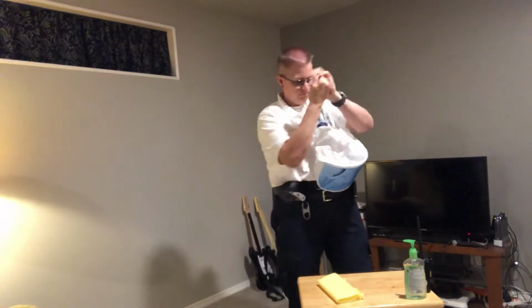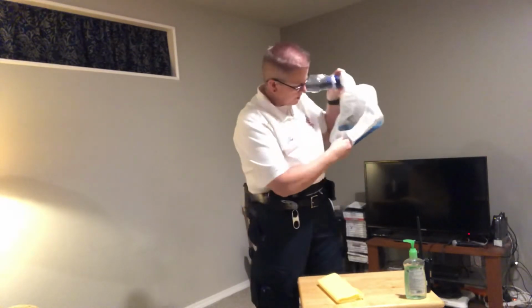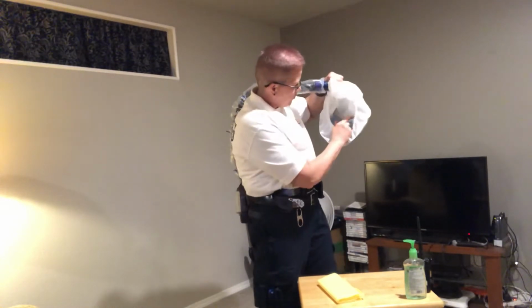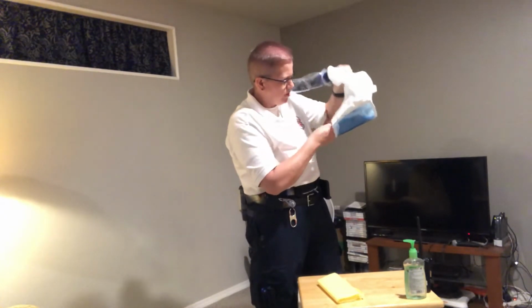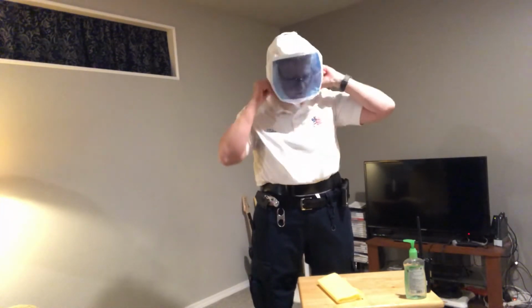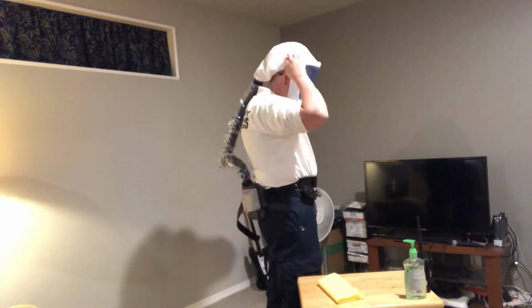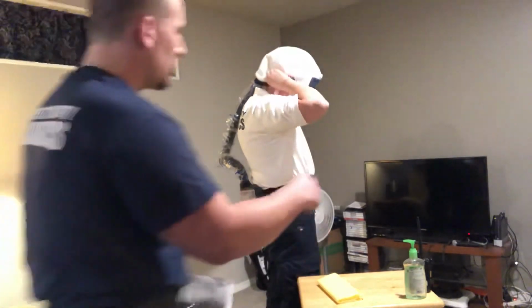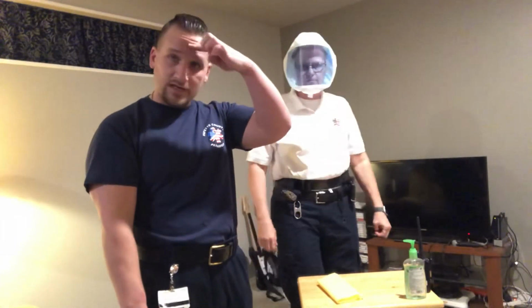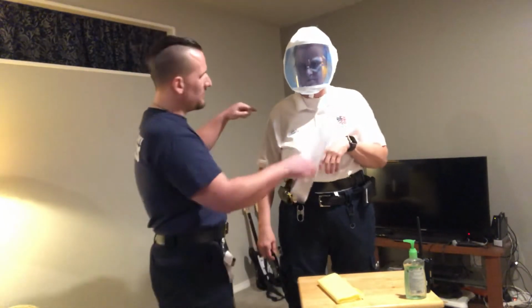All right, so once those hands are dry, she's going to actually put the hood of the PAPR on now. There's a little tab on the bottom that you can hold on to. And then the foam goes on your forehead and the white part goes on your head, just like a ball cap. And then you can pull it down. I know she might be hard to hear now with the hood on, but basically what she's saying is that foam will sit right across your forehead. If anyone's ever put on a football helmet, it'll sit right across your forehead like a football helmet. I'm not sure how well you can tell that with her right now, but if you could turn that.